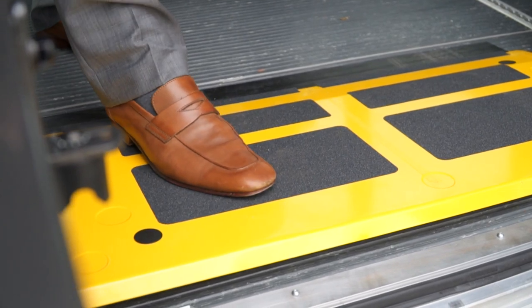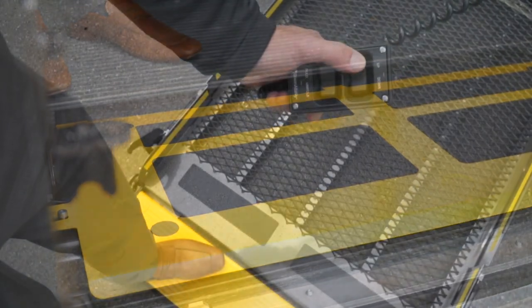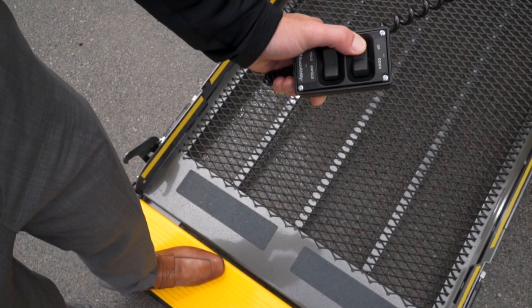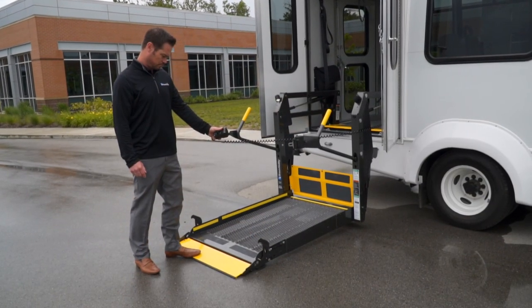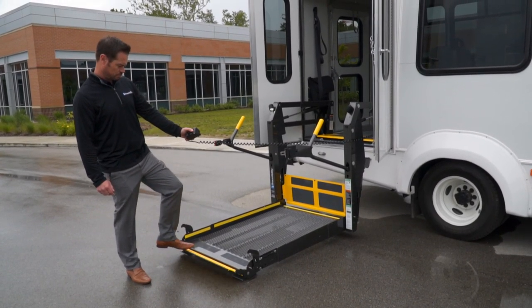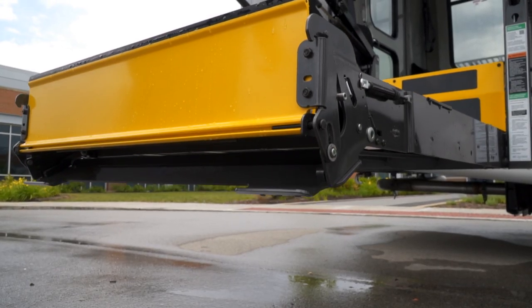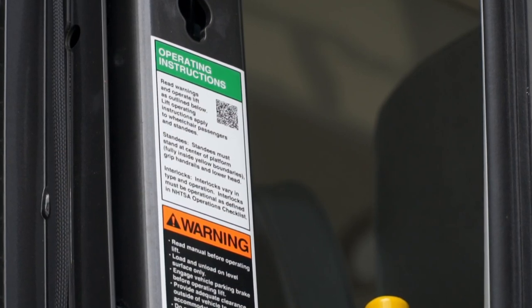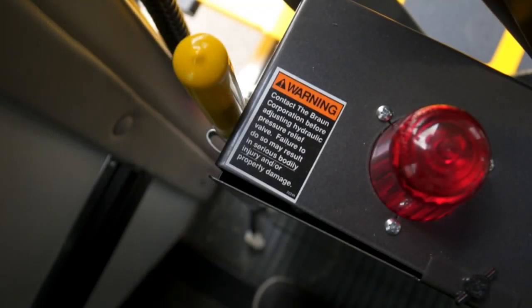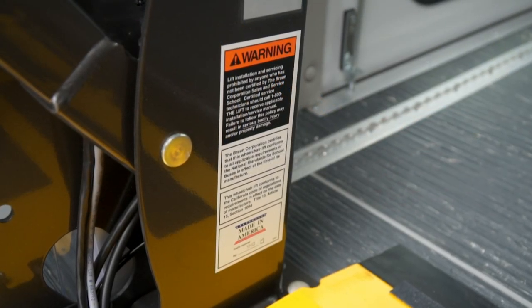Movement of the platform will be prevented by the interlock system if the inner barrier is occupied or doesn't transition to its fully upright position. Similarly, when the platform is at ground level, the outer barrier forms a bridge between the ground and the platform, and upward movement of the lift will be prevented by the interlock system until the outer barrier is fully upright. Although the BraunAbility public use lift offers these safety features, it's important that operators read all warning and caution labels and adhere to their instructions each and every time the lift is used.